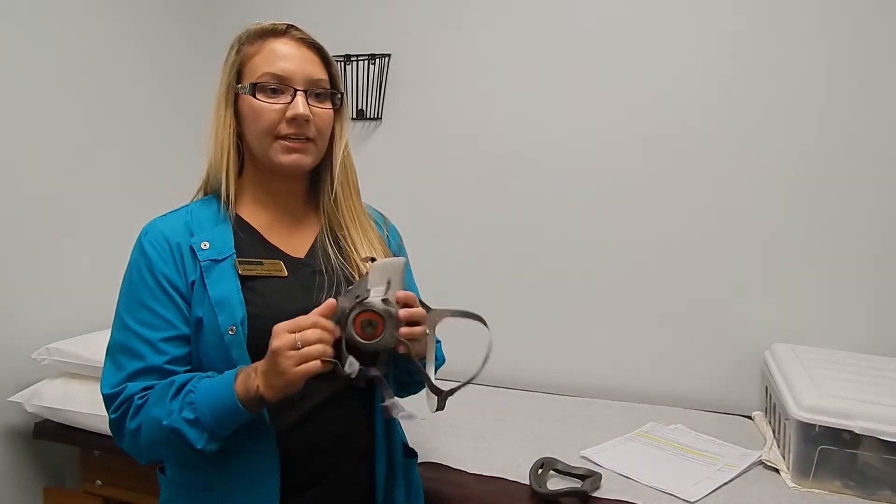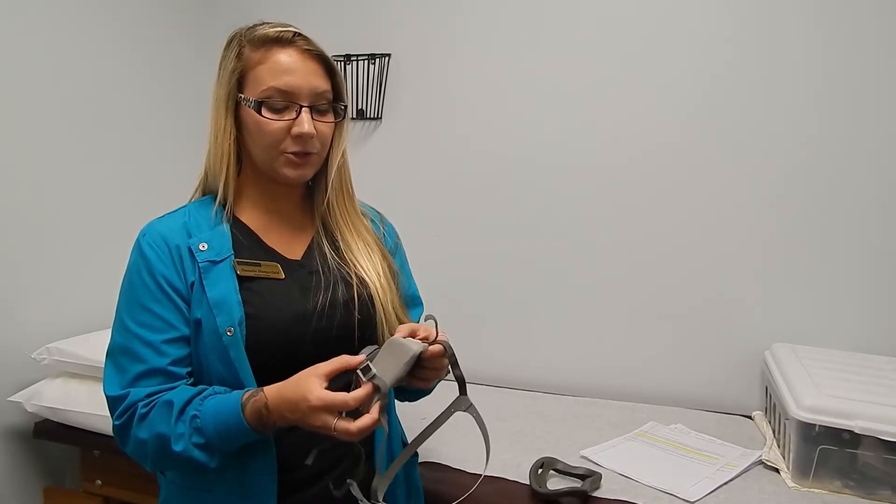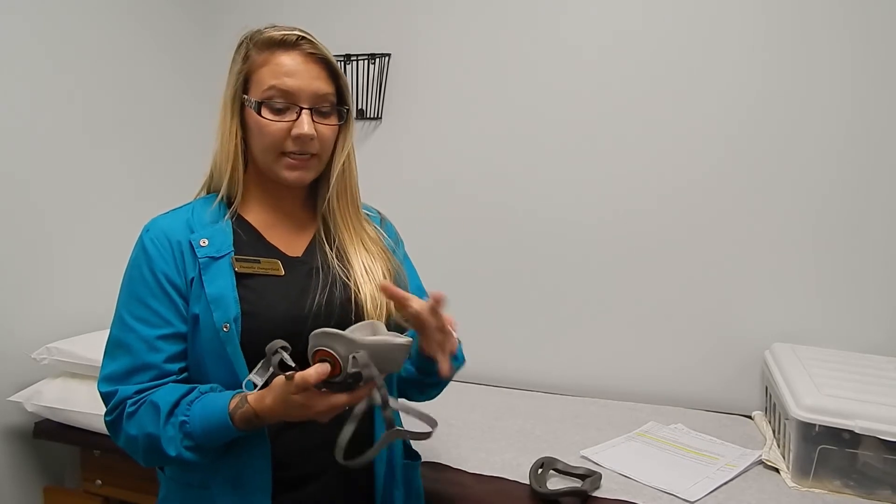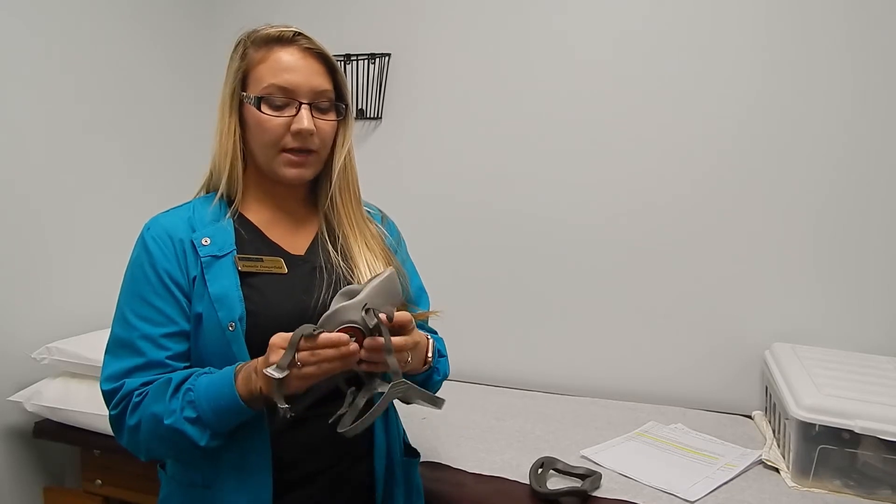My name is Danielle and today we will be going over the qualitative fit testing procedures. Before you actually get fit tested with your respirator, we will do a sensitivity smell test to make sure you can smell, so you know that there's never a seal leak in your respirator.